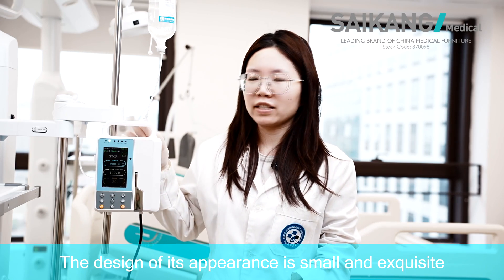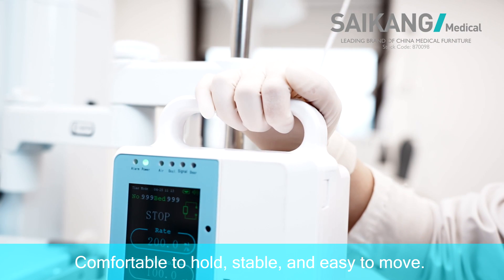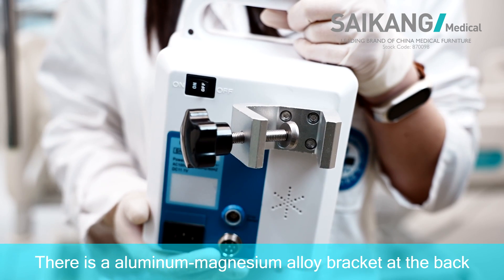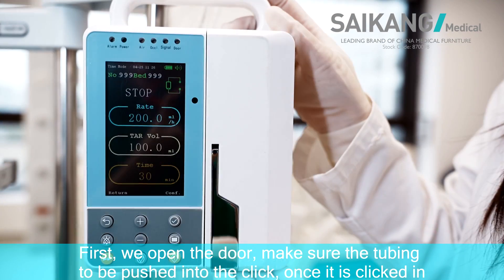The design of its appearance is small and exquisite, with a fixed handle — comfortable to hold, stable and easy to move. There is an aluminum-magnesium alloy bracket at the back, and the screw hanger can fix on the IV pole.